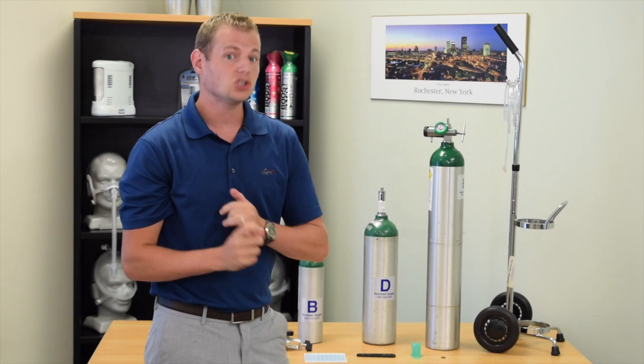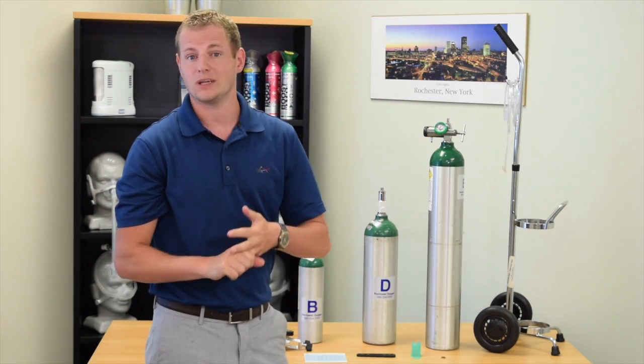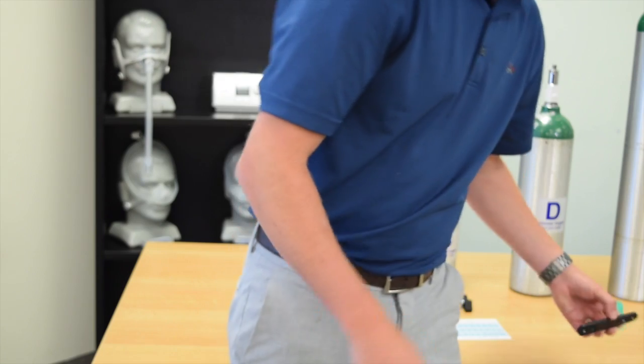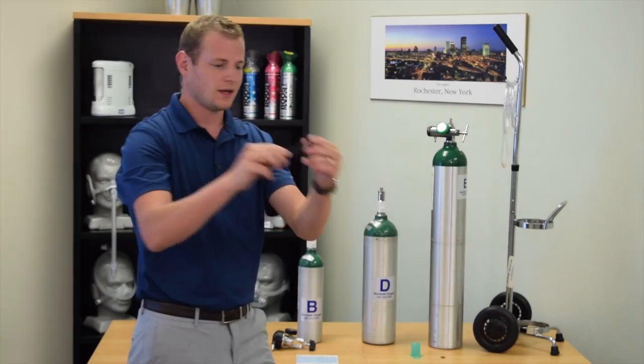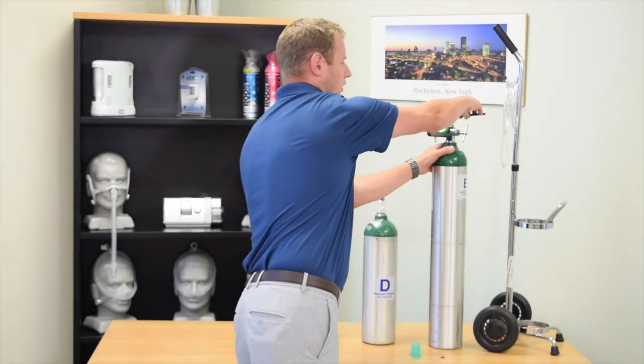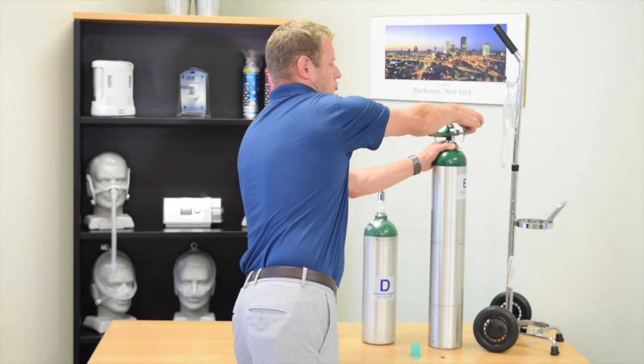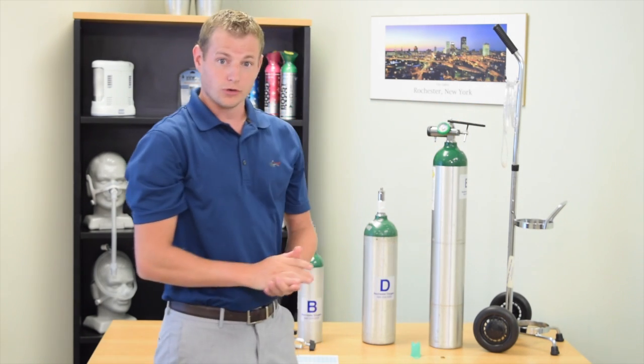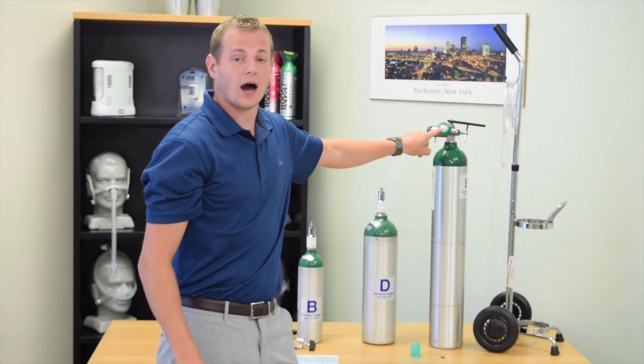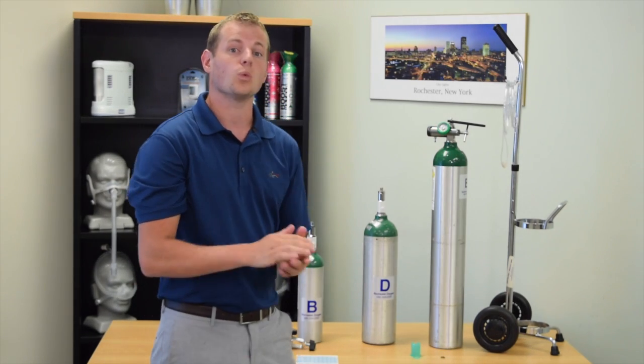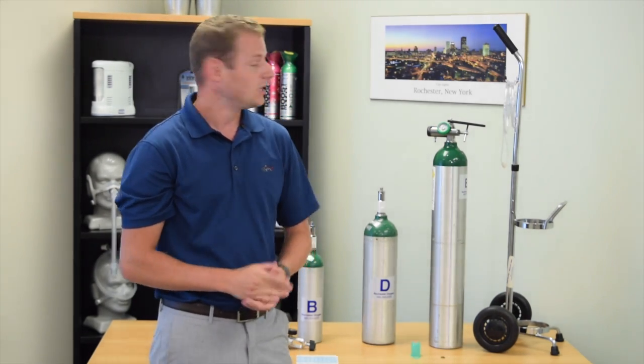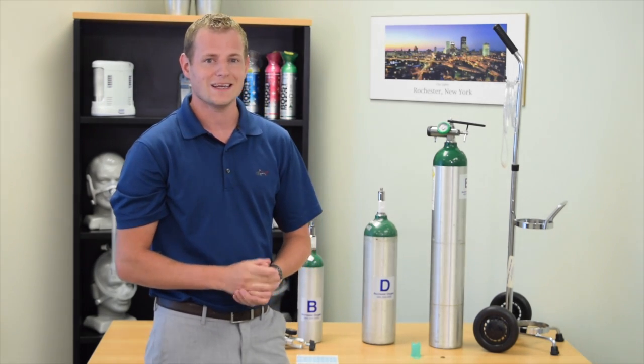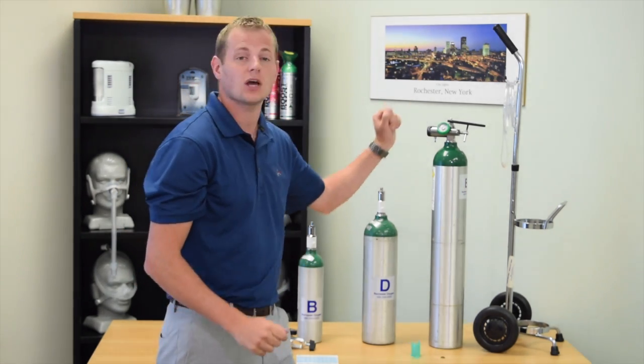Twist your T-bar until the regulator is secure. Now at this point, your gauge should still read zero and your liter flow dial should also read zero. You can then take your tank wrench, set it on top of your tank, and twist in the counterclockwise direction. You will notice the dial on your oxygen regulator gauge will go up to 2000 psi. 2000 psi is where all new tanks should read. It's shaded in a green color.